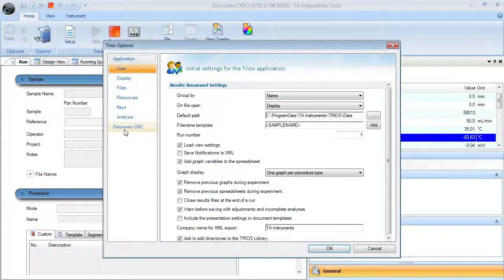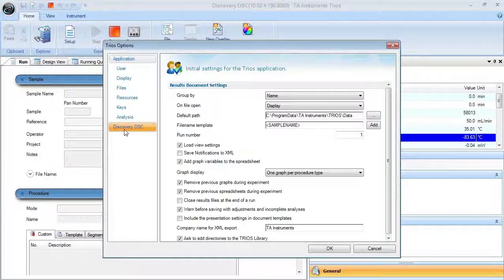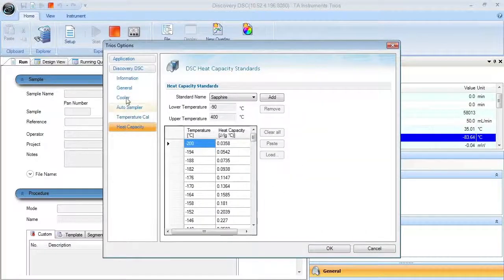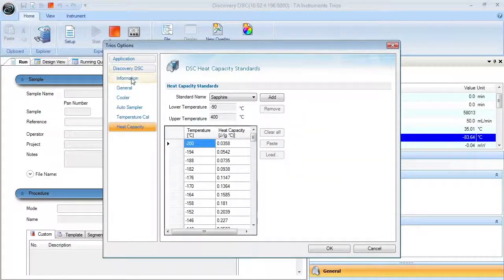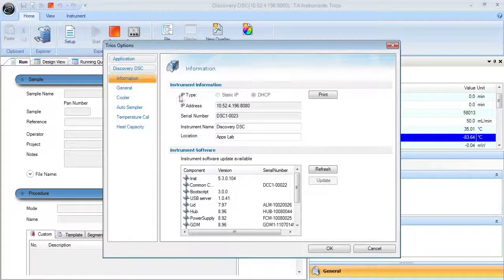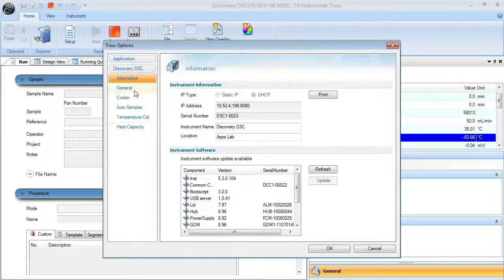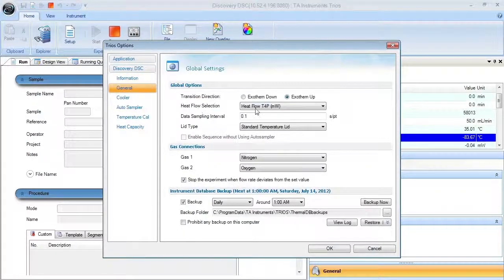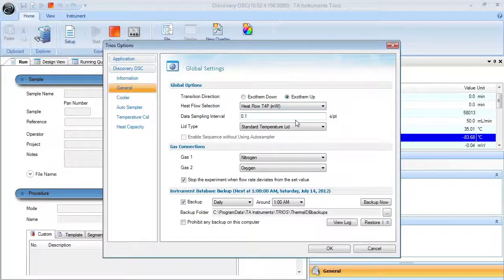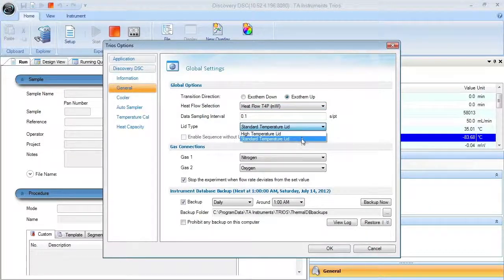Within this window, you will find information regarding the Discovery DSC. The general tab allows you to select the heat flow, lid type, and gas connection.